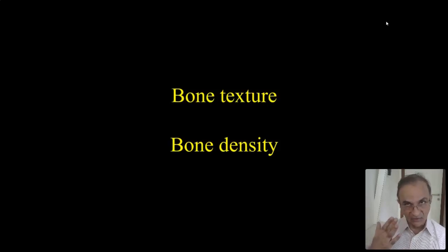These are words, okay? You must be wondering what is going on, so much description in words. But if some of this rubs off on you, as we see examples going forward, you'll realize that these words are important. So bone density is simple. By and large, most of us can tell the bone density is less than normal. Now, bone density less than normal is not common in skeletal dysplasia.